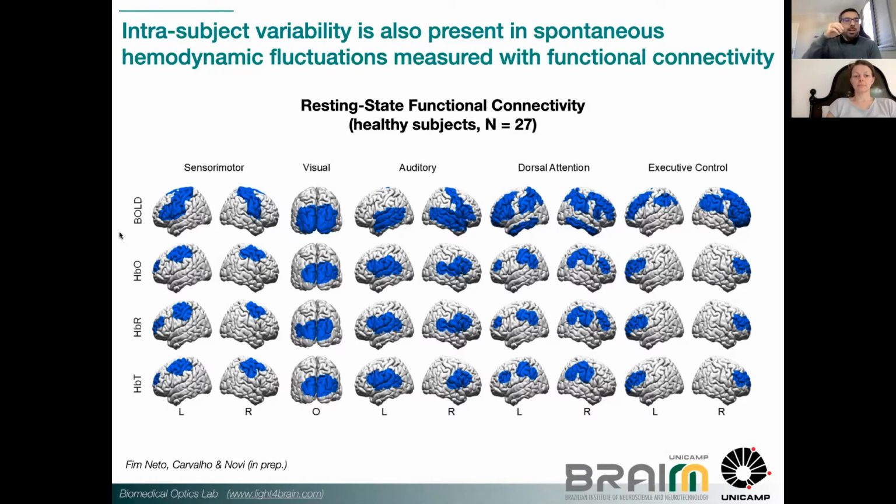You can move the time series or the region of the brain that you are interested in, and you can find different regions all the time. So in the top row, each column shows the region we are looking at, and each column shows the other regions that are temporally correlated according to the contrast that we were looking at.